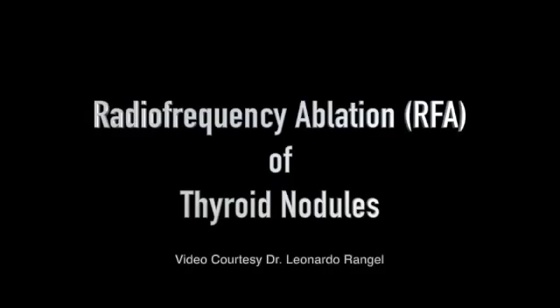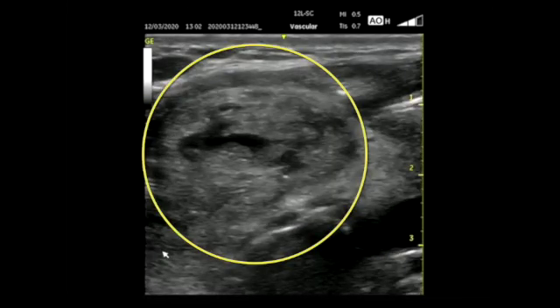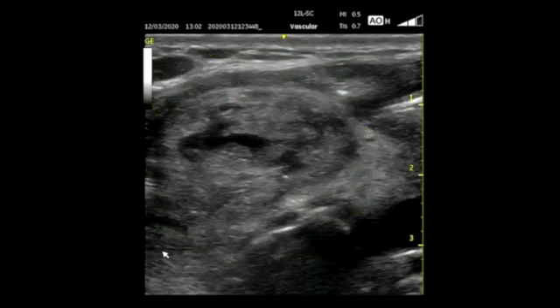Let's talk about radiofrequency ablation of thyroid nodules. This is an ultrasound of the thyroid gland. In the yellow circle is a thyroid nodule. You can see that it has a black center.